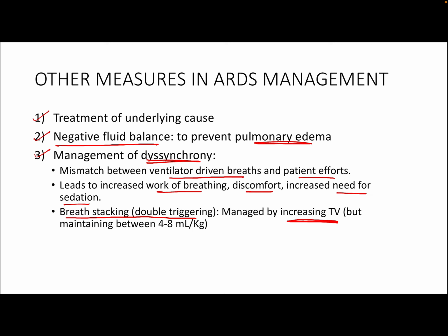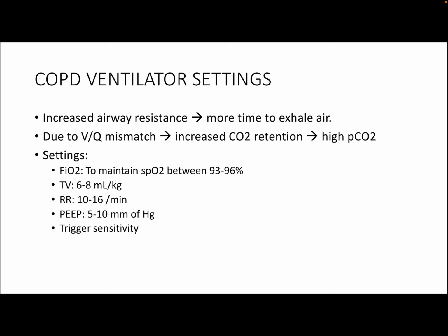And again, please note, when you increase the tidal volume, you have to maintain it at that low tidal volume ventilation range. So this is in the management of ARDS. Coming to the ventilation or ventilator settings that you use for a patient with COPD.